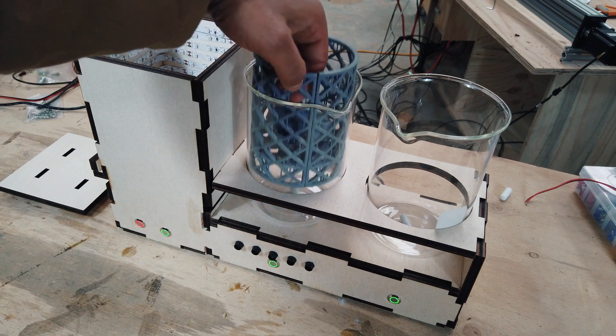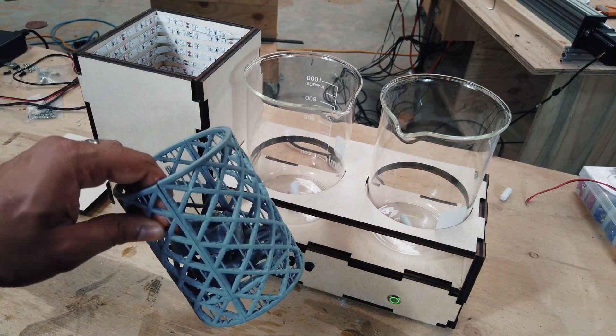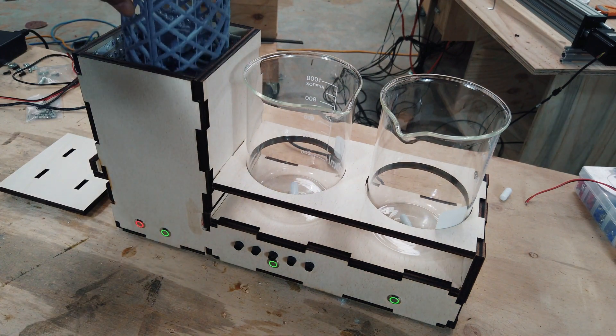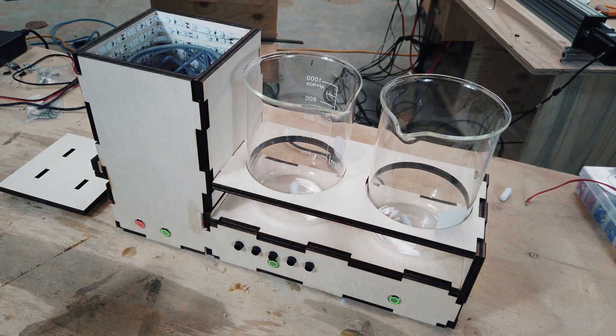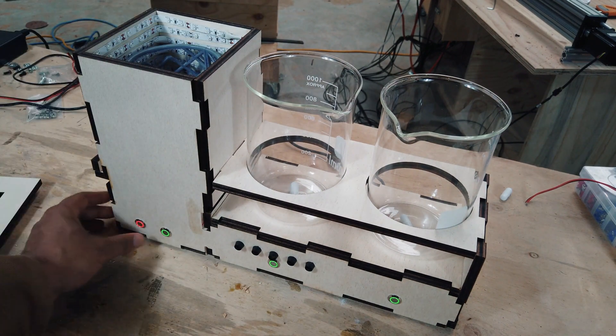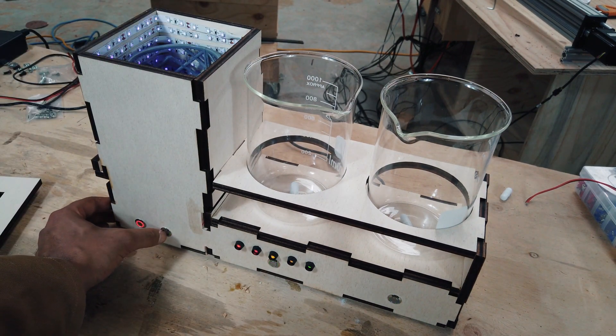And then lastly, you're going to air dry this now with an airline which you'll have in your lab. Once it's nice and dry, pop it into the third station. I'm going to leave the lid off so you can see.